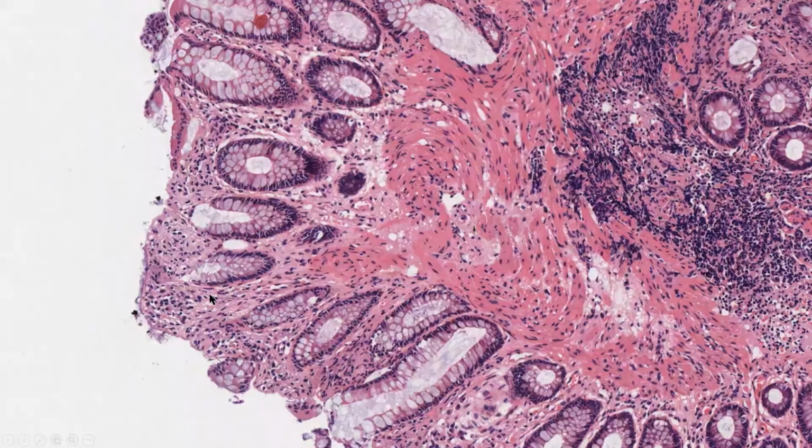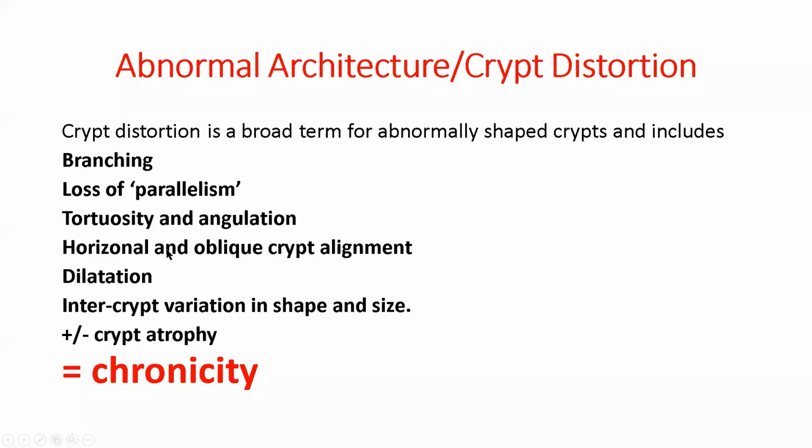Here again, the superficial part of that crypt, and that's a close-up of those couple of crypts, it is gone. You see, this is an ischemic event, and this shouldn't pass lightly. You don't let something like that pass in your biopsy lightly.